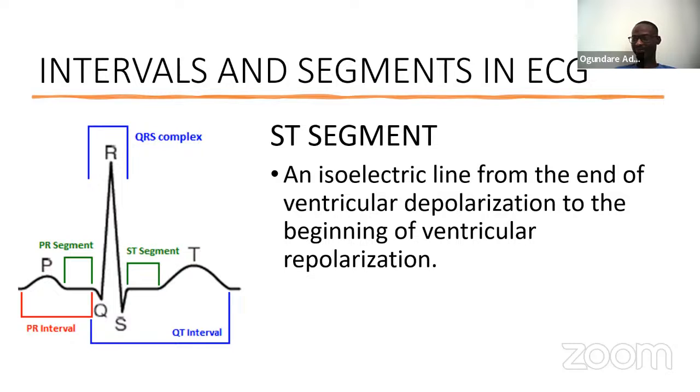And I'm sure you might have heard of STEMI and NSTEMI, ST elevation MI and non-ST elevation MI. That tells you that the ST segment is also significant in diagnosis of myocardial infarction.